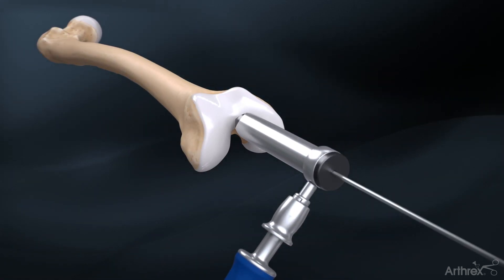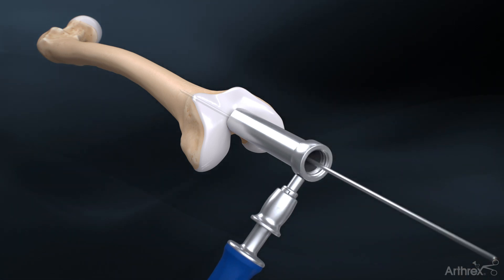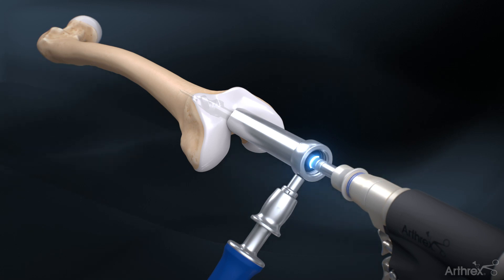Insert the 3.2 mm guide pin through the soft tissue protector assembly directed down the central shaft of the femur. Remove the black pin guide and ream over the guide pin with the 13.5 mm cannulated entry reamer until the groove on the entry reamer is in line with the top of the soft tissue protector.